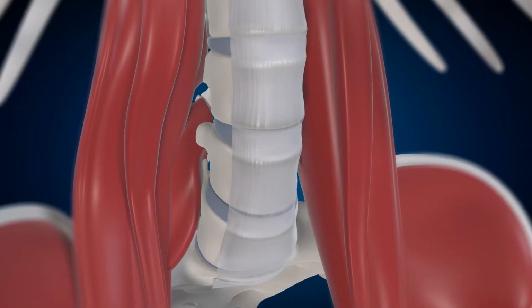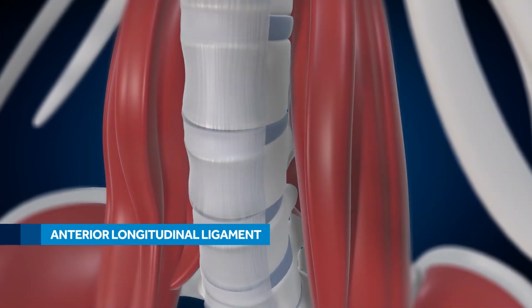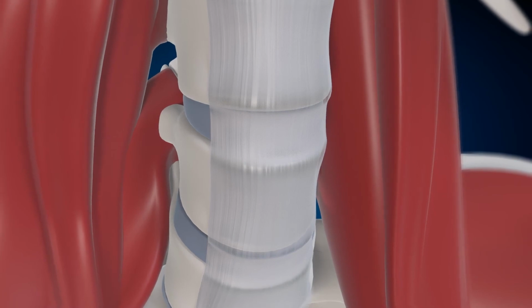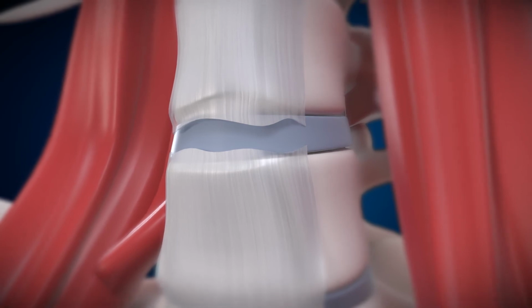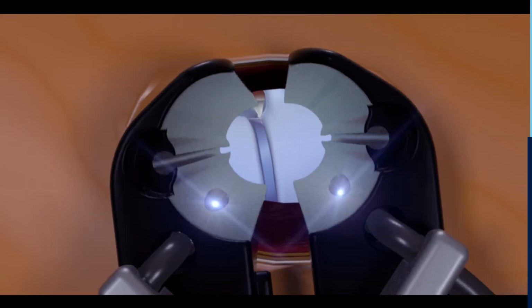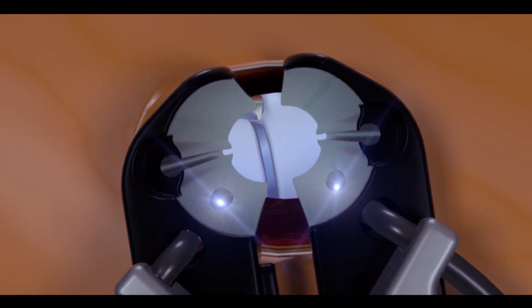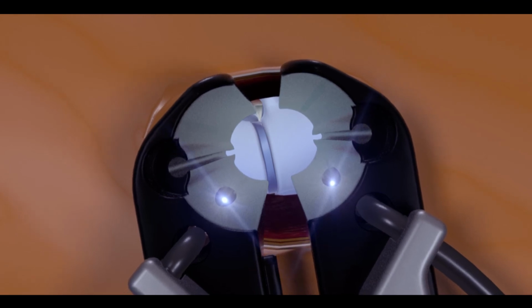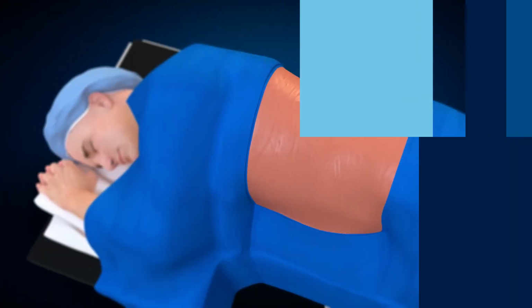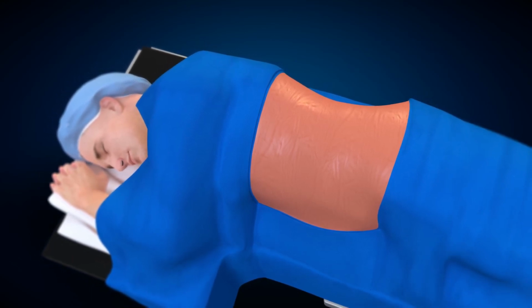The ALL is attached to each vertebral body inferiorly and superiorly at the end plates level. OLIF25 allows direct visualization of the ALL, and surgeons may leave the ligament intact or release the ALL for greater lordosis. The OLIF25 procedure enables an approach away from the nerves of the posterior aspect of the psoas and works away from the peritoneum and anterior vascular structures. The OLIF25 procedure allows direct visualization of vital structures so they can be mobilized and protected.